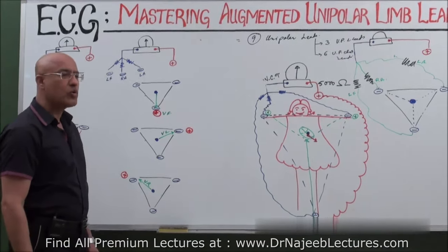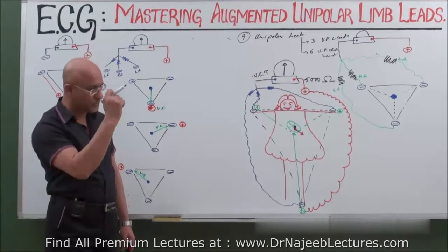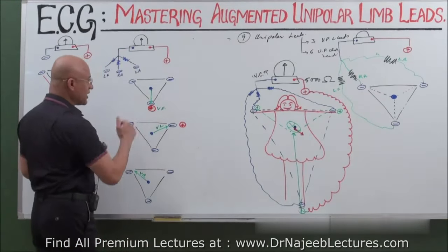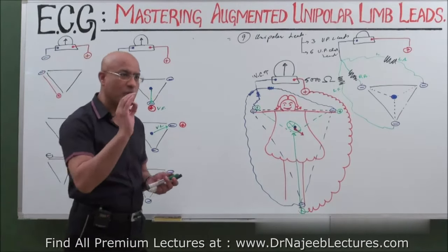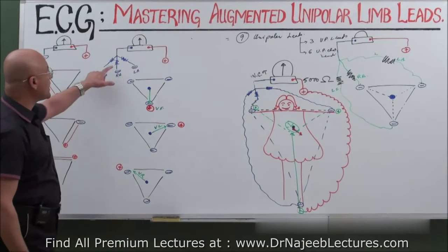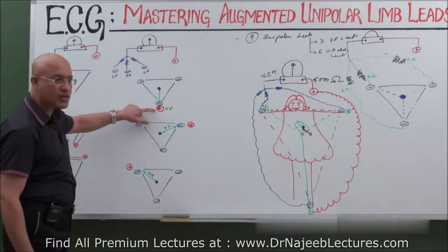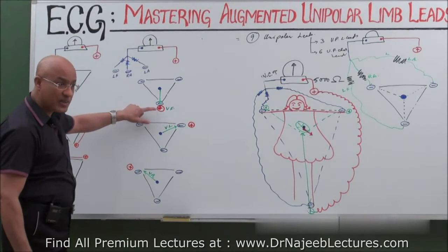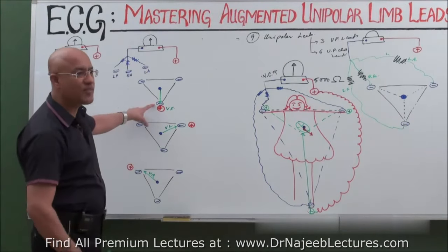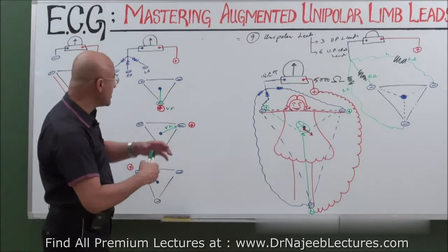Right? So Goldberger and friends thought they had a golden idea: magnify the views. So how to magnify the view? Goldberger came up with a golden idea. What was that? The idea was to modify the Wilson common terminal in such a way that wherever you put the positive electrode, at the same place, the negative should be inactivated. Negative should be inactivated. You are understanding?